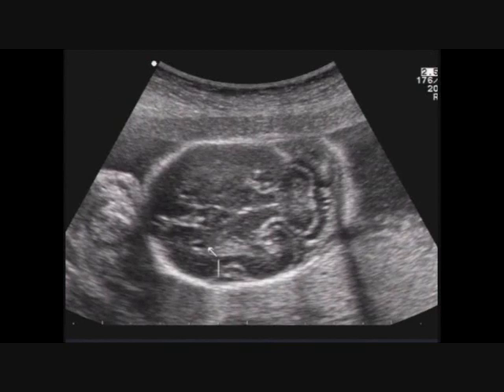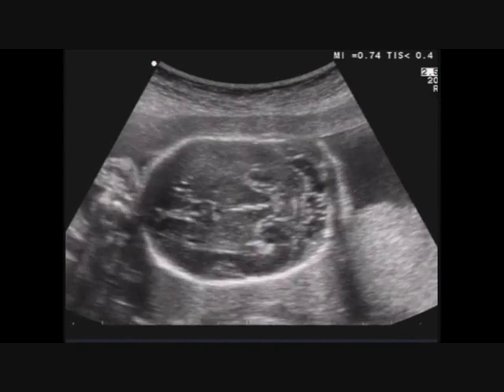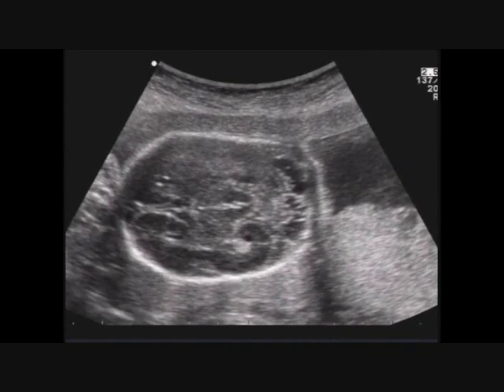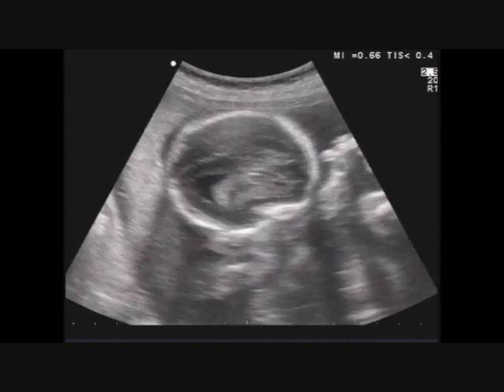After, you can see the frontal horns. This is one, and this is the other one. The presence of a clear separation between the two brain structures tells us that the frontal horns are separated. Now you can see the third ventricle that is irregular. In conclusion, we can say that there isn't a hydrocephalus, neither a borderline hydrocephalus.